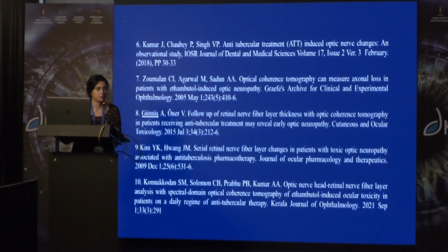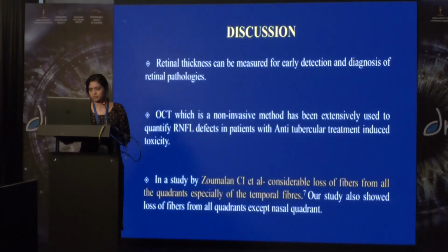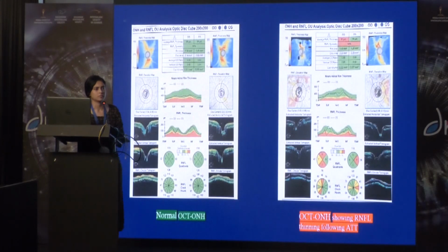Thank you. Will you please show that OCT picture again? Yes. Both sides, you have shown. Yes. That is normal. Yes, sir. This was taken before the treatment. Okay. Then after undergoing ATT, post 3 months, it showed significant thinning of RNFL.